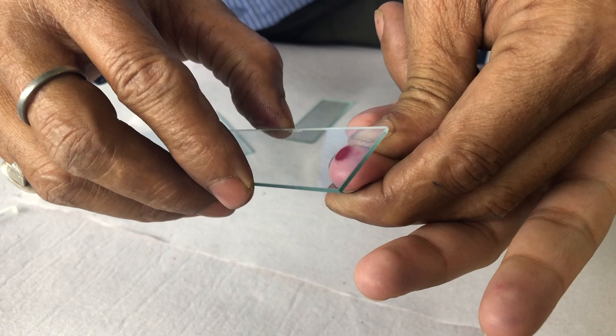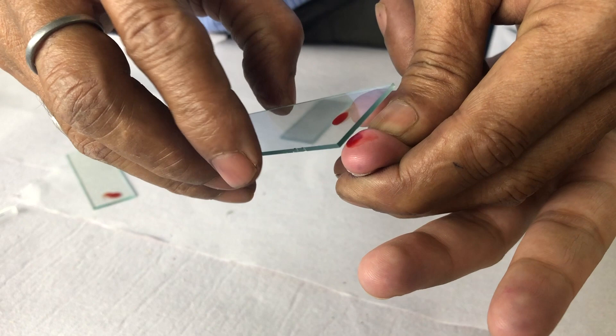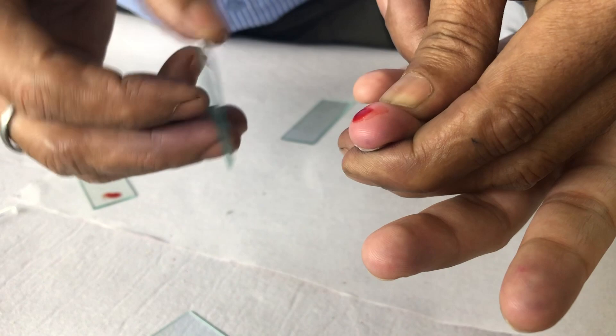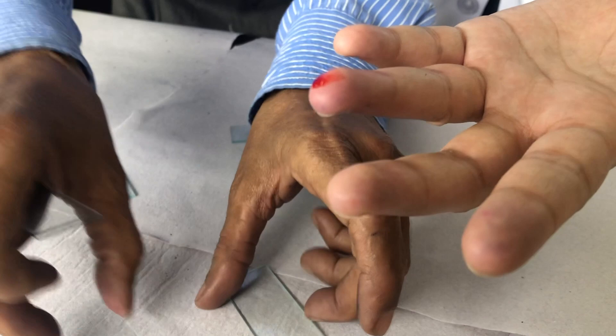A drop of blood would be taken on the slide for making the smear. You can take several slides for making multiple smears.